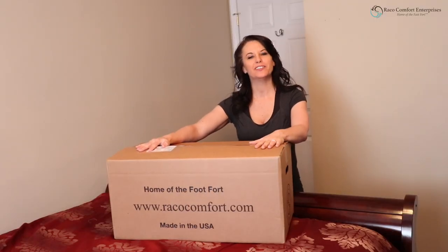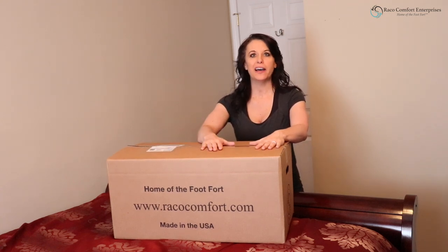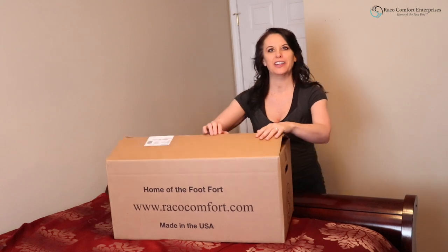Hi, I'm Molly. I'm here to talk to you about a fantastic product from Rayco Comfort Enterprises. It's called the Foot Fort. It comes shipped to you in a box just like this. Let's open it up and check it out.